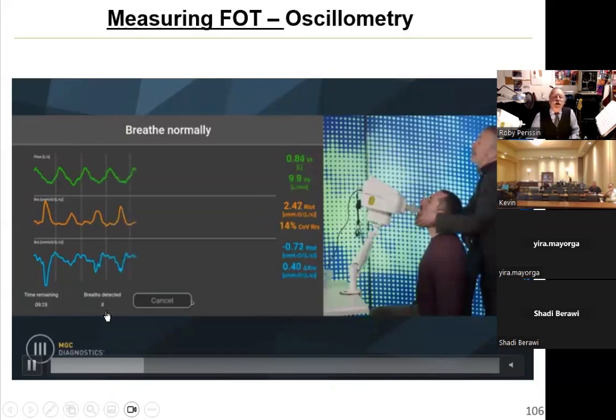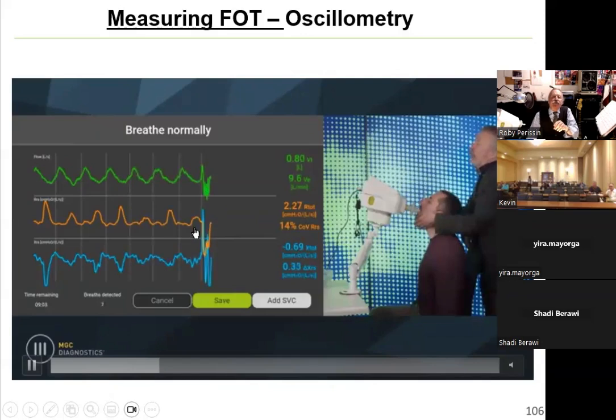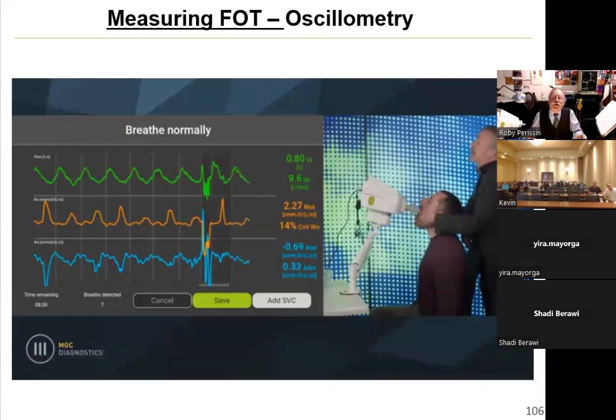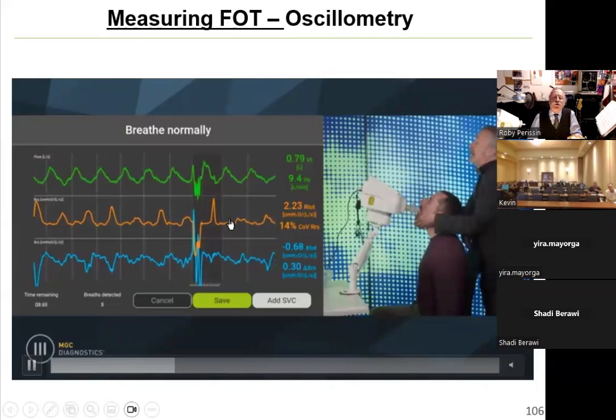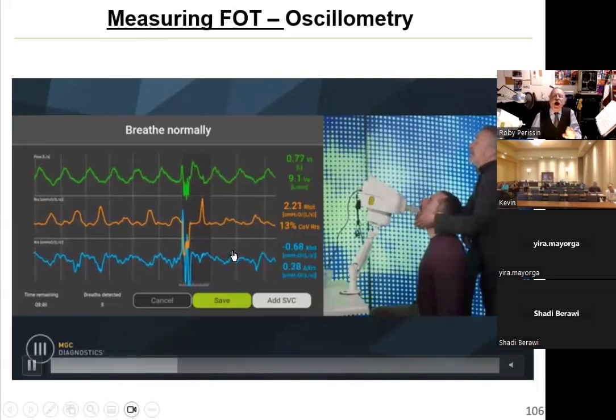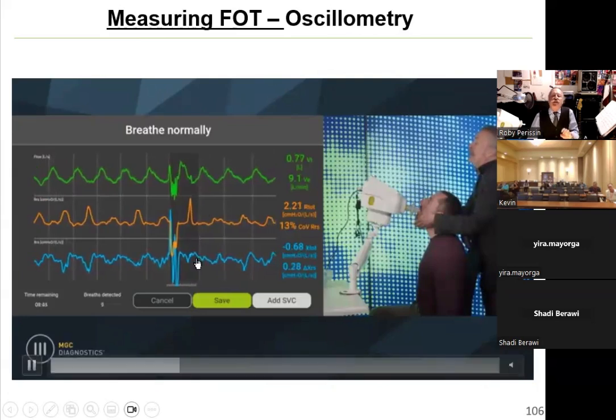see the count. And if the patient coughs, and I will suggest you to do it, cough, you just close the glottis, do something odd, and the count will stop. So here is the cough, and the count has stopped at number 7, and it will resume only when you will see acceptable results until breath number 10, when the test is over. This is how you perform a forced oscillation test.